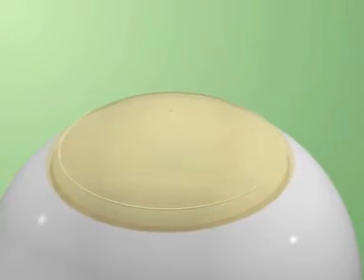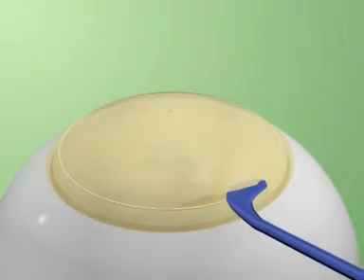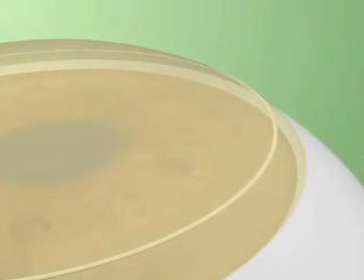A vacuum trephine is used to make an initial partial thickness groove. Lamellar dissection is carried out in two stages and directions. First, centripetal dissection is done to remove the lamellar corneal disc from the host tissue to create a central bed. Following complete dissection of the bed, an intrastromal pocket is created in the periphery circumferentially.